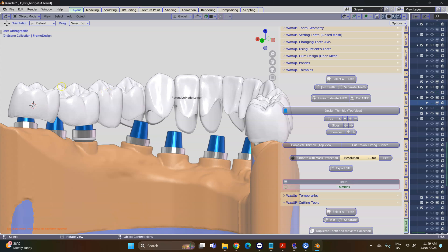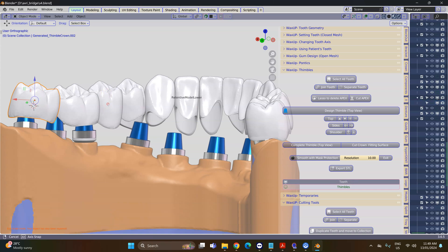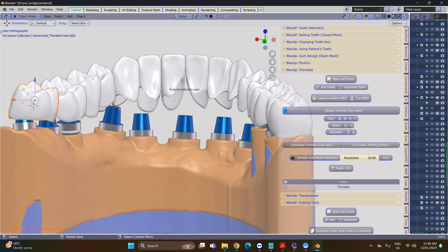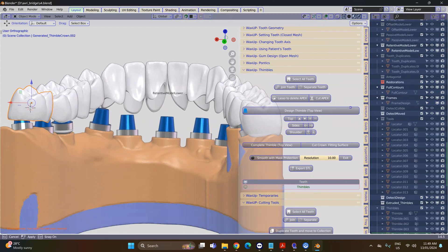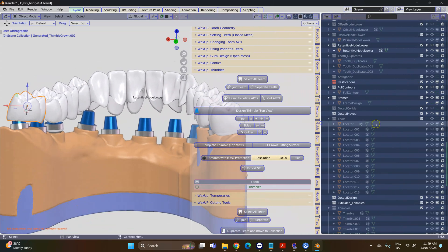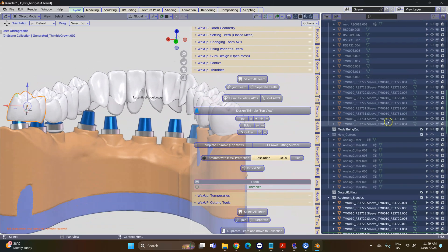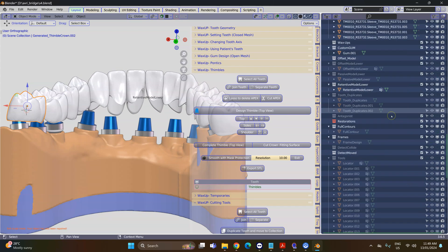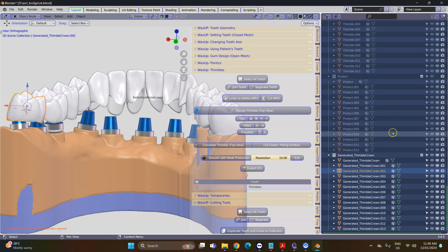So our thimbles are hidden. Select your generated thimble crowns, go to the Outliner and just simply hide the entire collection.